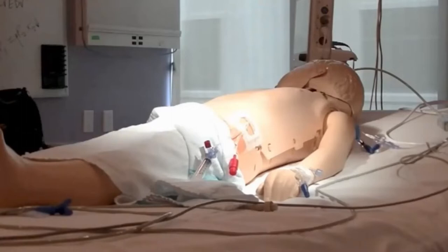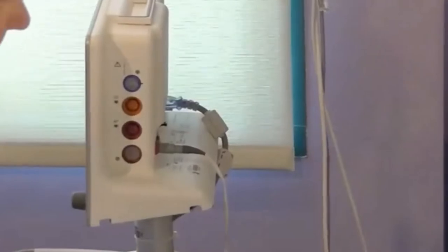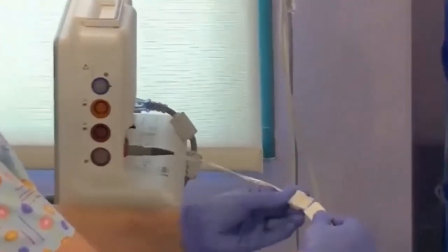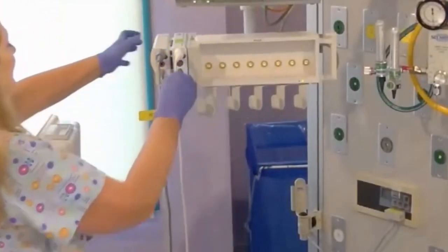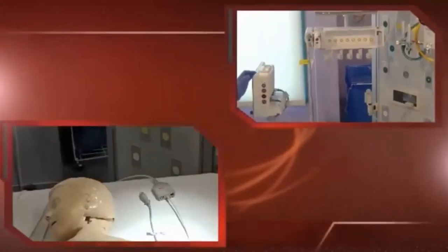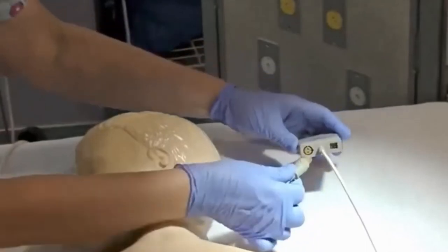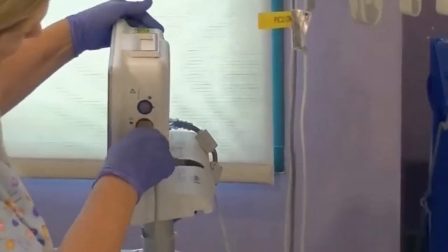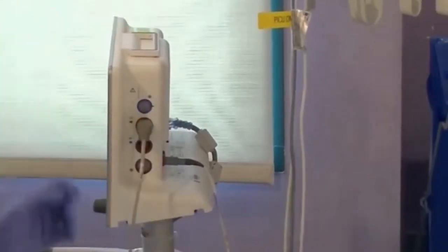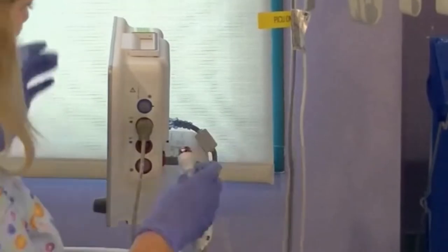Now let's begin the setup process. Plug in the PiCCO monitor. Now connect the white plug PiCCO arterial transducer slave cable from the back of the PiCCO monitor to the Philips cable. Connect this cable with the Philips interface box or module. Connect the inject temperature cable to the brown socket of the thermistor cable. And then connect the thermistor cable to the orange socket on the right side of the PiCCO monitor. Lastly, connect the pressure cable that will be used later to connect with the arterial transducer.